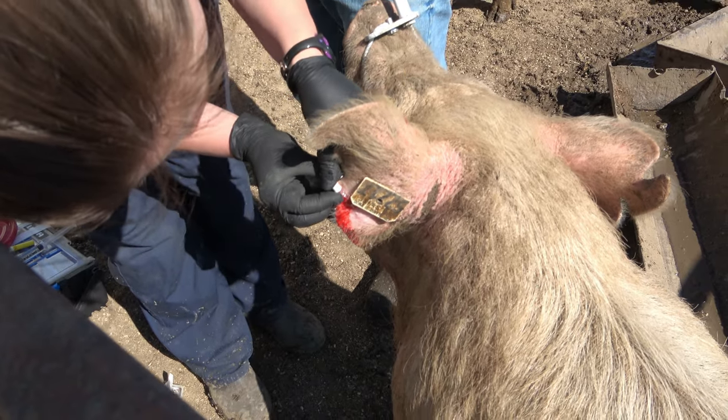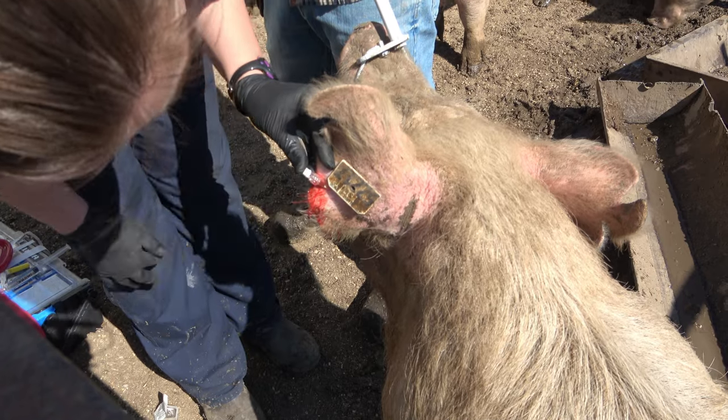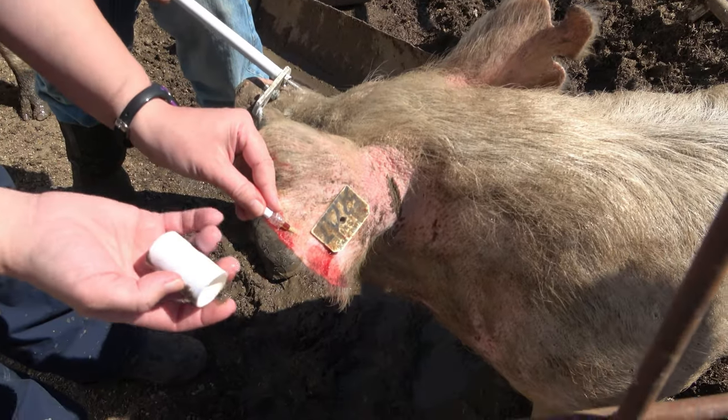Now we're gonna tape this in. Whoops. There we go. Do keep your thumb on that cap while you're working on taping. All right, so I have my catheter in place with my cap on here.